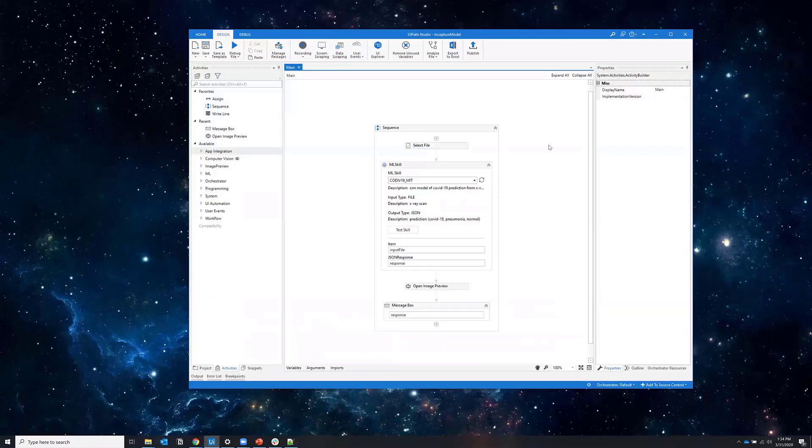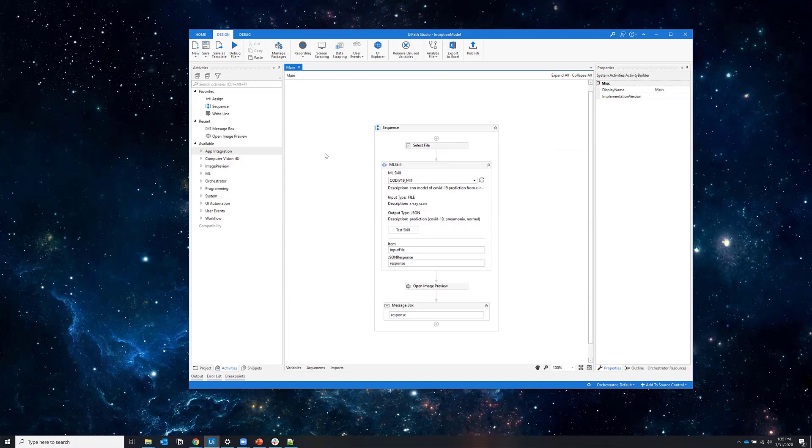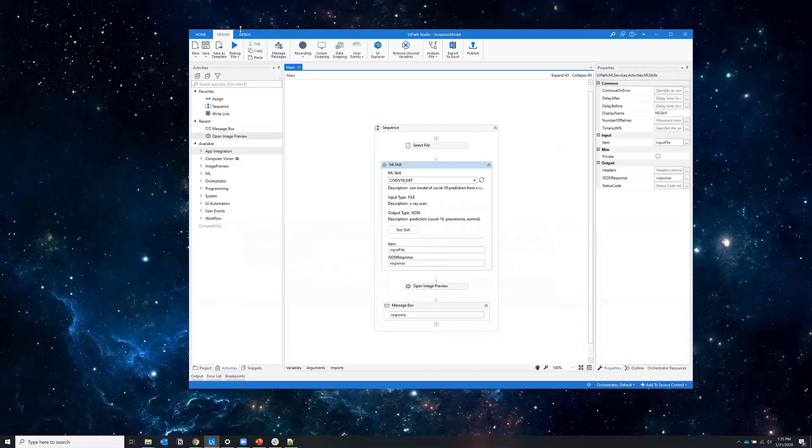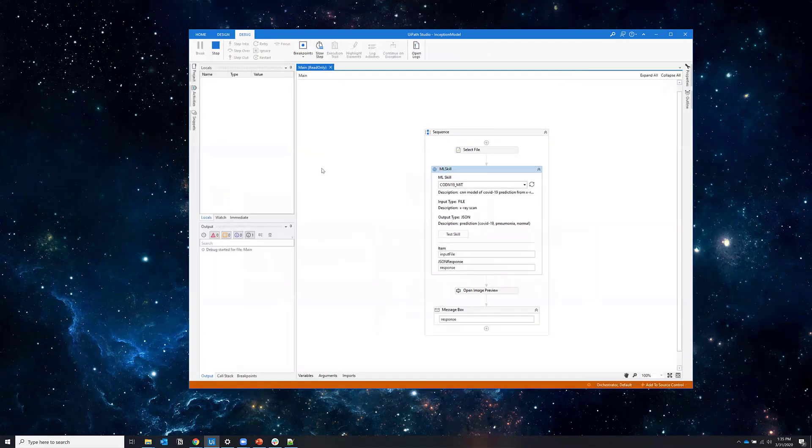So right now, I have the model pre-trained and deployed on AI Fabric. Opening UiPath Studio, I have a very simple workflow in which I select a file, an x-ray image, which I send to the machine learning model and the UiPath robot receives the results.